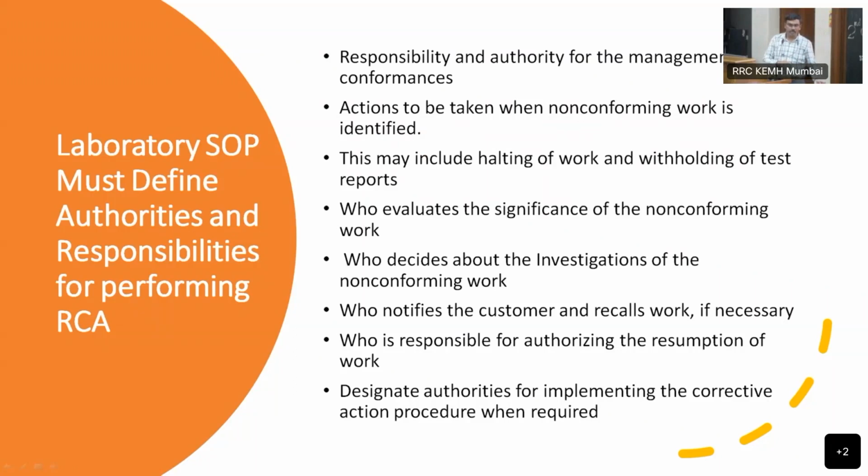After coming, he got one sample absolutely bizarre, one control. It was absolutely out. Okay. Then I asked, what is the issue? Then he checked, the technician only checked what is the timing of the sample. Okay. And he related with the temperature. At that 15 minutes only, the AC was shut down because of electric issues. And that particular run only happened. You got it. You got it.